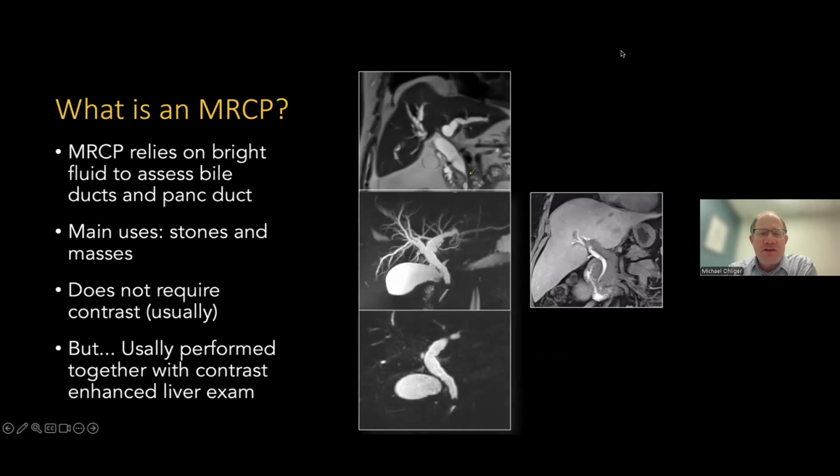And so first, I think I'm just going to start, right? So basically MRCP, so it's the magnetic resonance cholangiopancreatography. And one thing I'll just say at the outset is I'm not going to talk about the pancreatography part about this, but really it's an MRI technique in which we can actually see the bile ducts and the pancreatic duct, and we can see them both really well. And actually it's something that MRI does extremely well, and that's because MRI sees fluid really well.